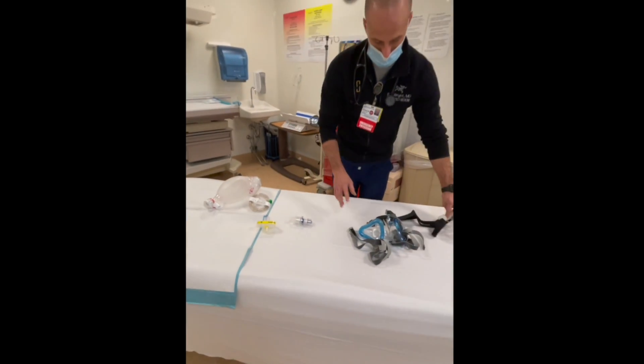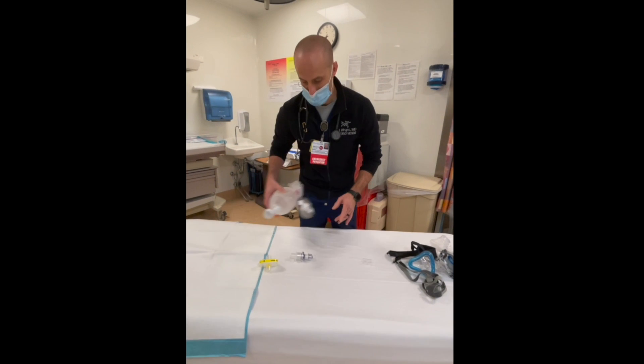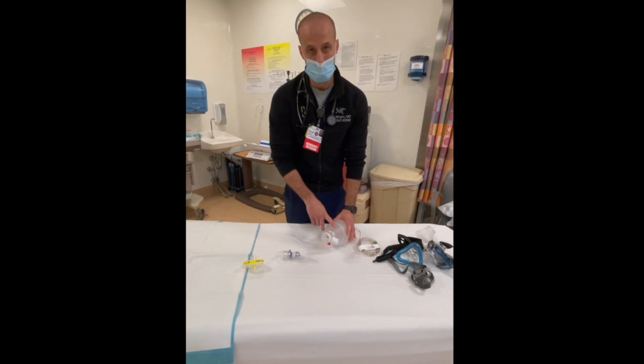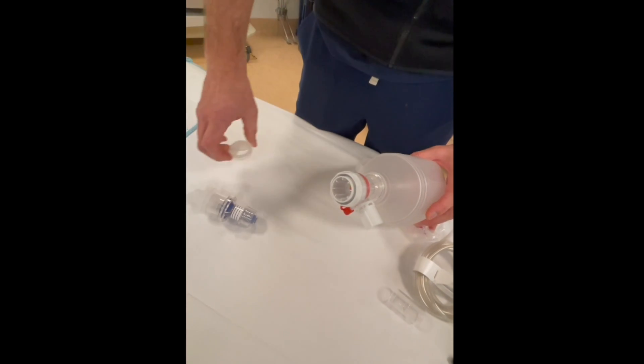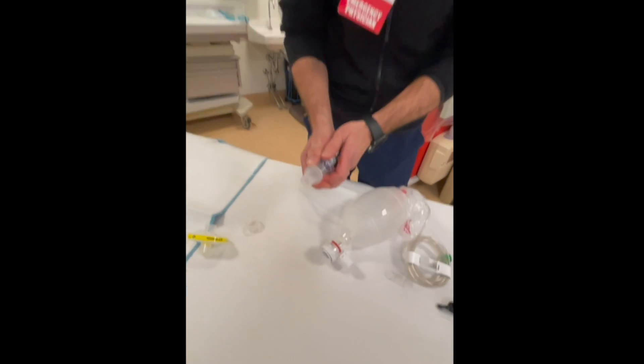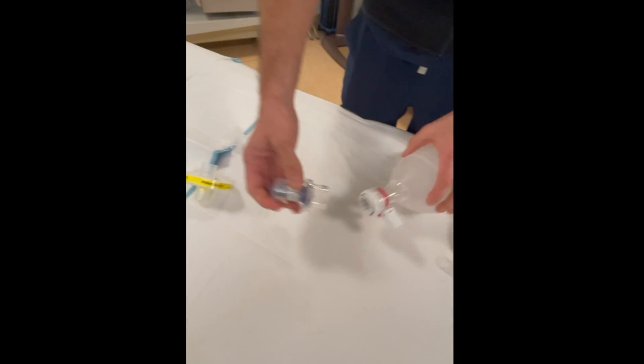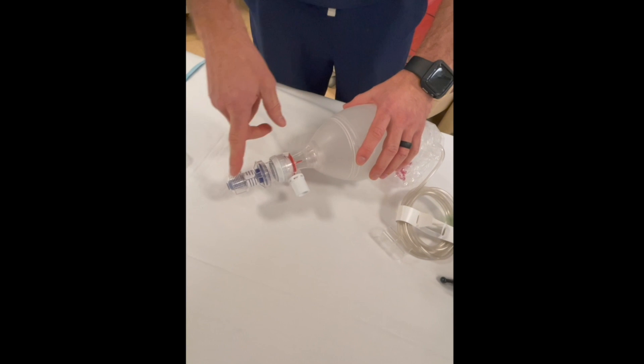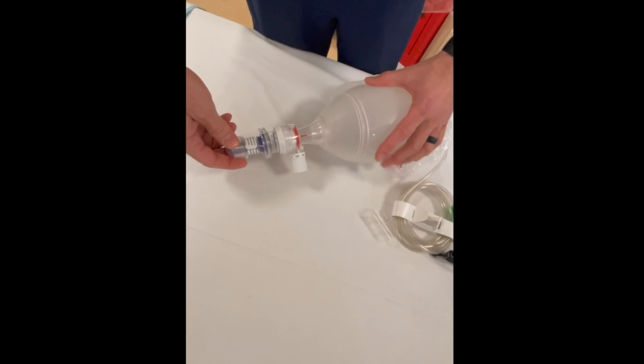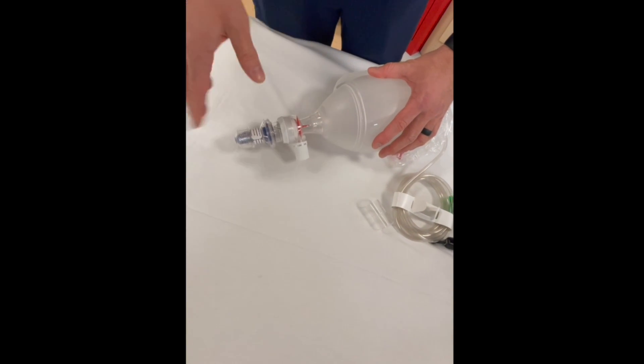On the bag valve mask on the end, you're going to see the exhaust port. You're going to remove this piece, remove the connector off of the PEEP valve, and then this is going to fit right on the end. This is actually going to provide your end expiratory pressure, and it's adjustable so you can go five, ten, or whatever you want.